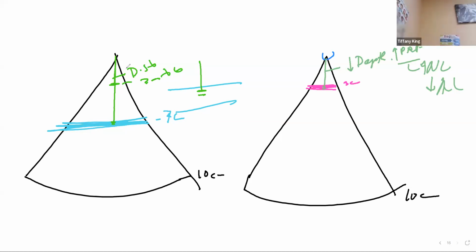Good. So what this step actually may require is a slide, physical manoeuvring of your transducer.